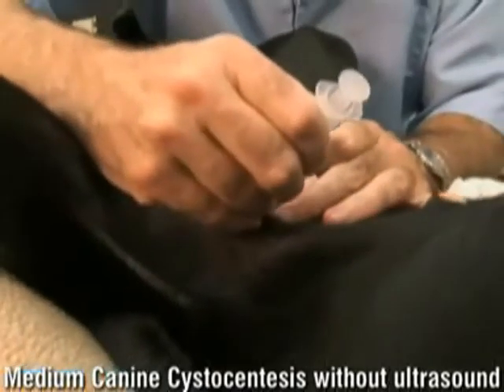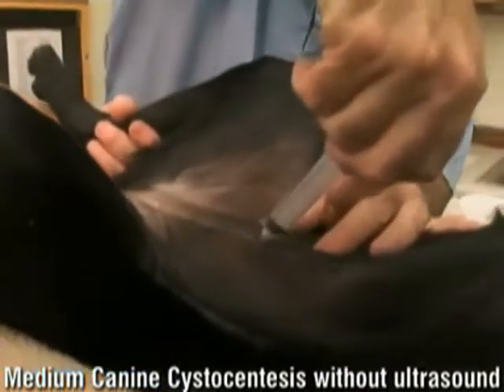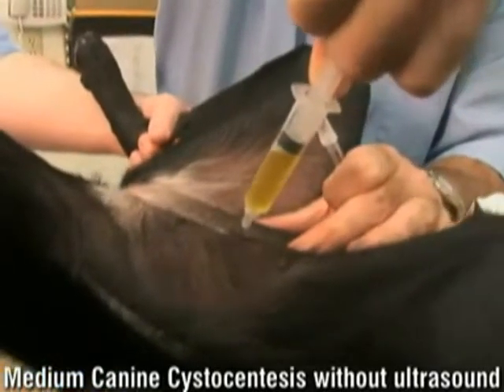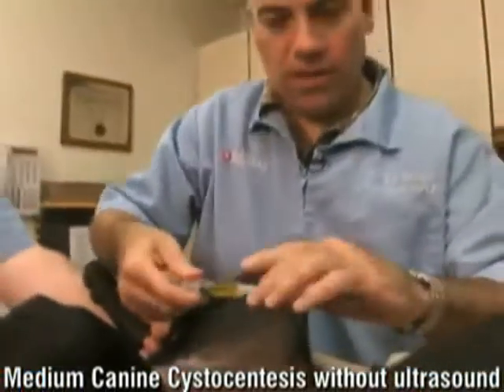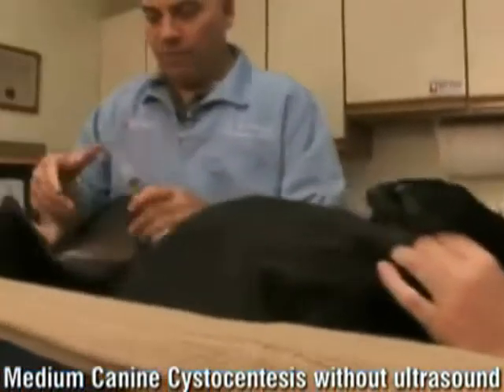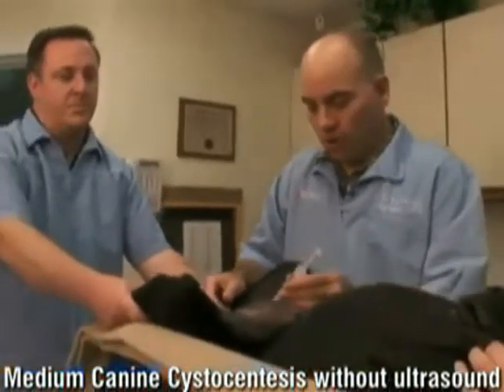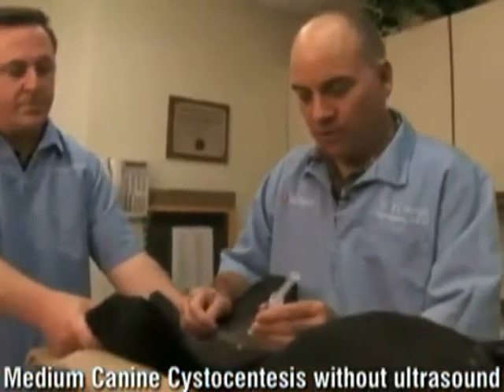What we'll do is use a technique where we take alcohol — is what we normally use. Pour a little alcohol, and where it pools is basically where we're going to put the needle. So you can see it's pulling mainly right in this area. We're going to take our needle and syringe, go at about a 45-degree angle. And there we go — a little jump there by my own dog. And there we go. Good girl, Zill. She was very brave. That's really it — we don't hold any pressure on here, we just let it up.